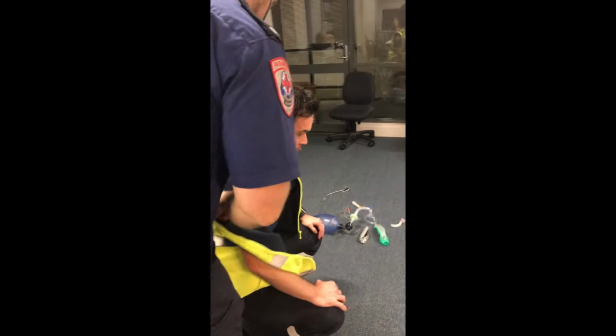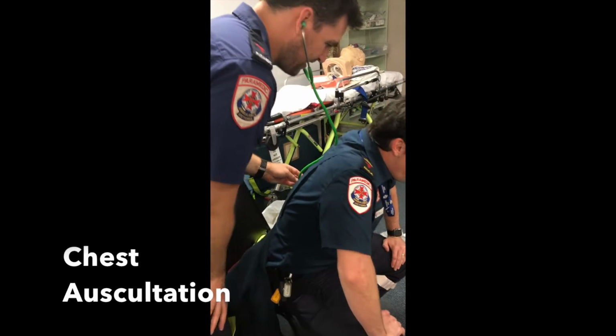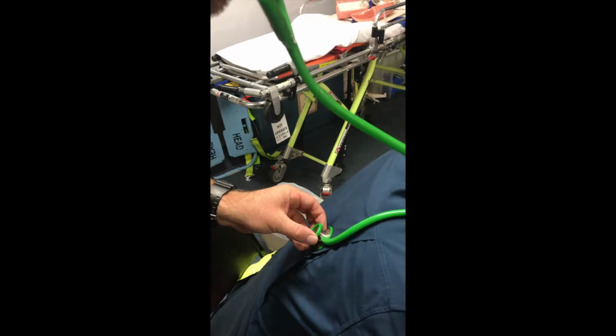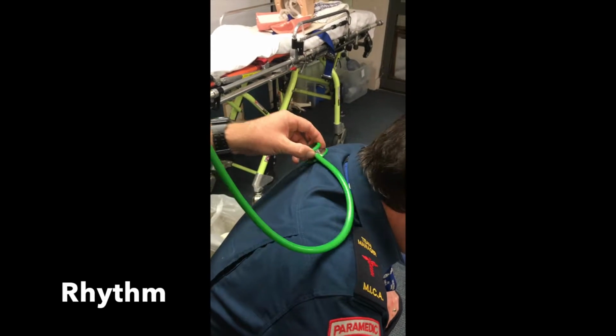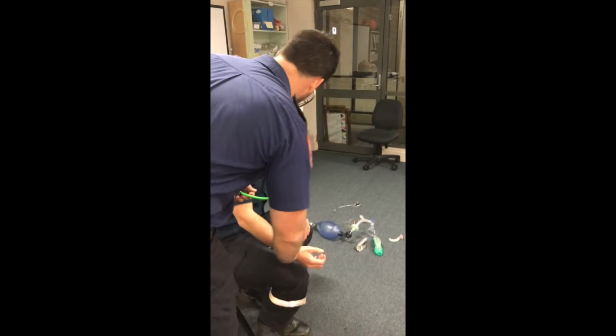Chest auscultation is integral to any RSA. Removing the patient's jacket and trying to listen to the chest on direct skin wherever possible. Listening at 6 points with 2 ventilations at each point. Whilst doing chest auscultation, respiratory rhythm can also be assessed for prolonged expiratory phases, for example.